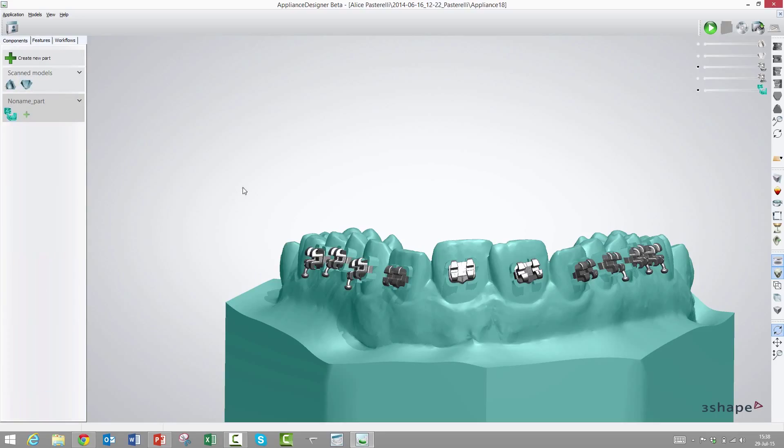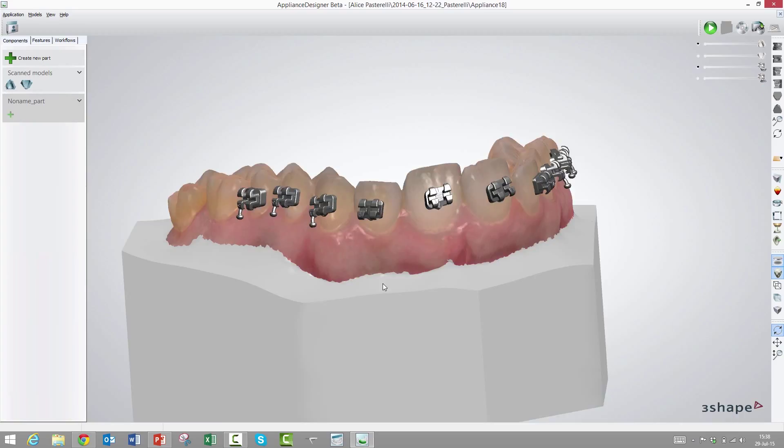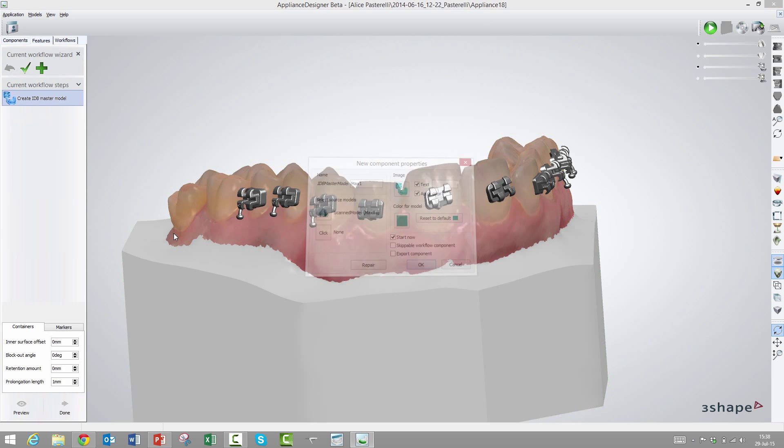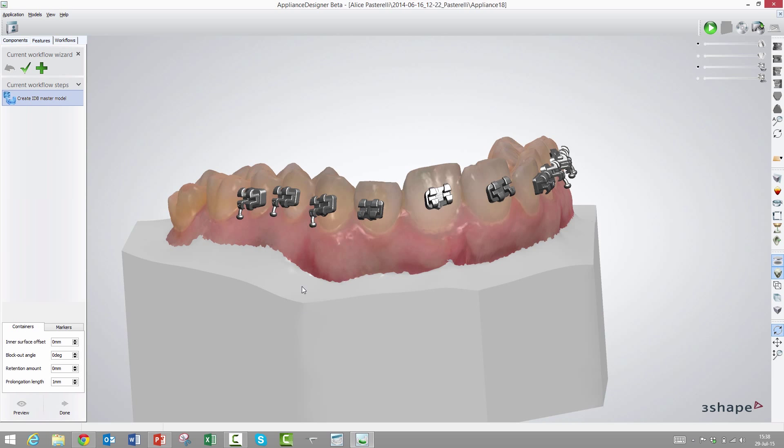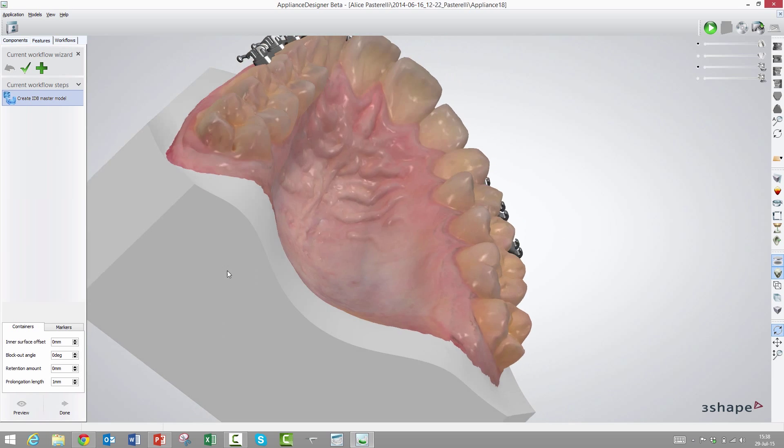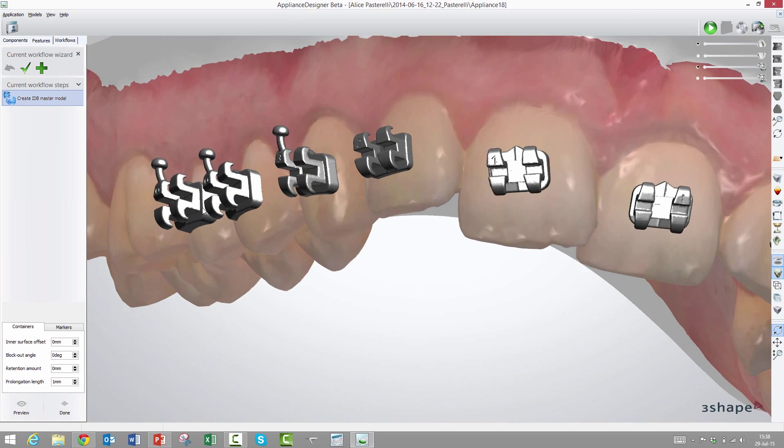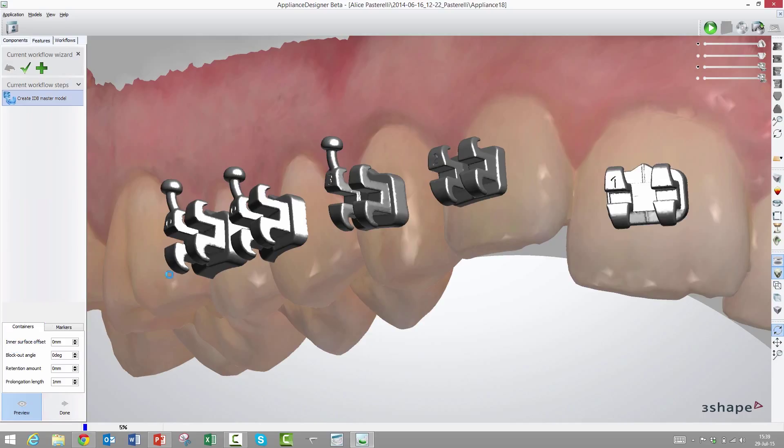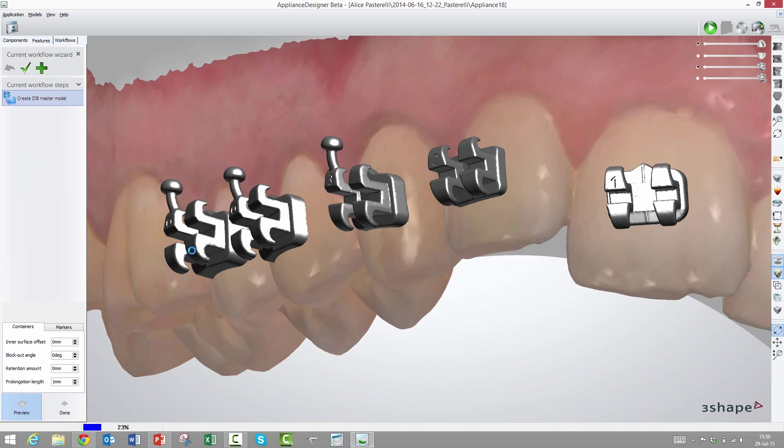The next transfer method is what we call containers. That is also something that you can thermoform on top of. We will choose indirect bonding master model and choose the container option. While it processes, I'll explain what the various parameters are. The first one is called inner surface offset, essentially the same thing. You can on purpose make these containers either too big or too small.